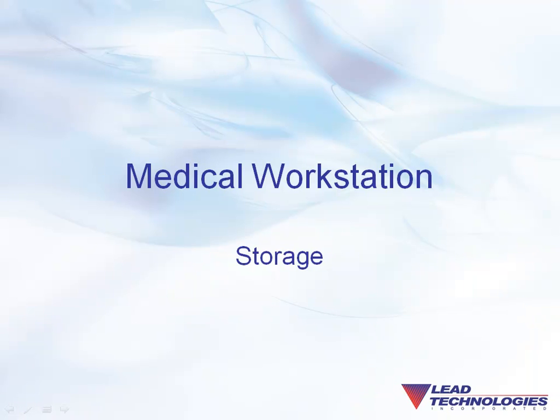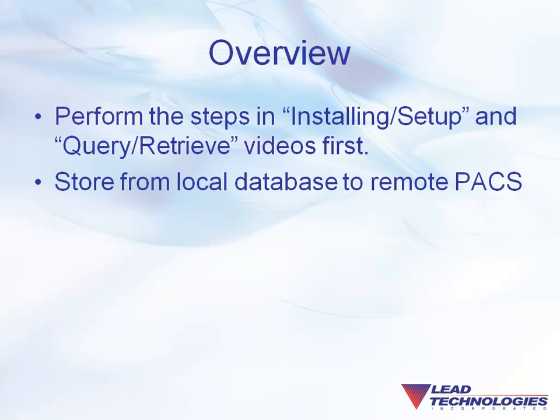This video will show you how to use our medical workstation viewer to store a data set from the workstation's local database to a remote PACS server.